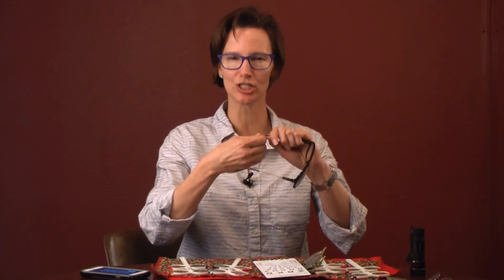Make sure the temples are fitting them around their ears. It's pretty easy just to bend the temples to get them so that they're not too loose. You'd hate for this to maybe be the only pair of glasses they ever get, and then out there in a couple days they fall off their face. So I try to make sure the temples are somewhat tighter, and again, they're metal wires. You can bend them, and if you break them, you start off with another pair.